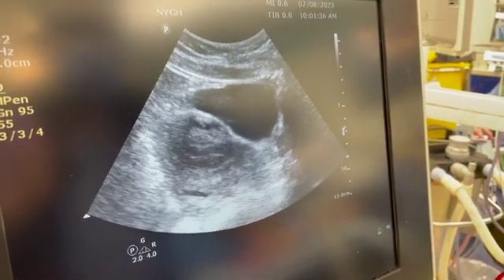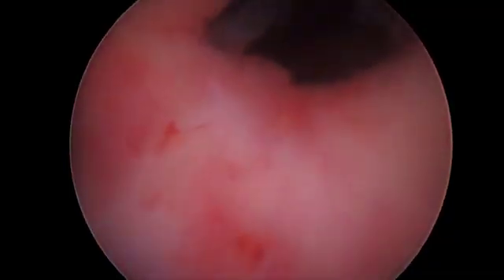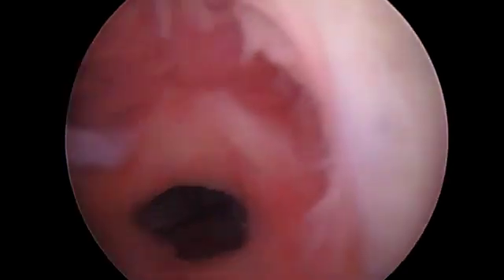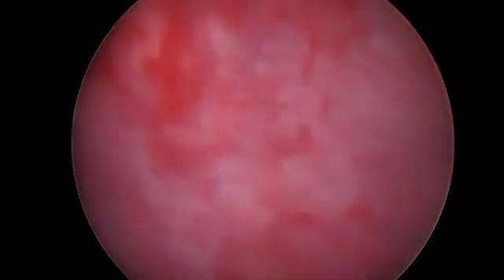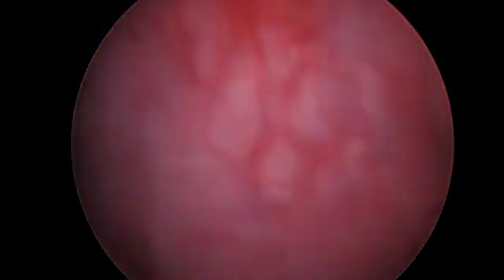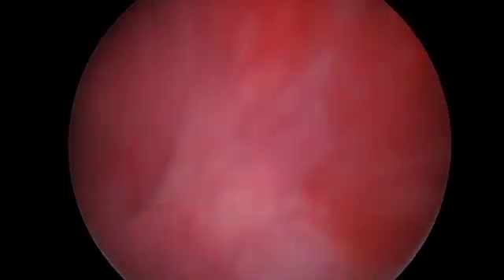Copious products of conception were aspirated. We then performed diagnostic hysteroscopy. The 10mm resectoscope with a loop electrode was used, using glycine as a distension media. Here we can see the space in the upper cervical canal that was occupied by the gestational sac, and beyond this we can see a normal uterine cavity through hysteroscopic inspection.